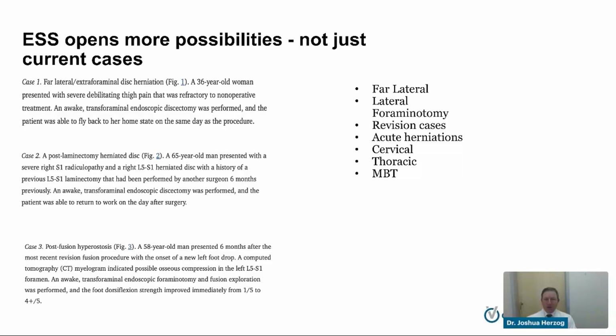I like to talk about what endoscopic spine can do. Not only can it do the same procedure with a smaller incision, but it can do different procedures. One of those examples is this medial branch transection. Whereas we used to still go in and burn the nerves, we can now go in and find that nerve and see the nerve because, again, we're blowing it up. It's a very small nerve, 1 to 2 millimeters, and we can see it and then sever that nerve or ligate that nerve. And that's just not possible necessarily with the naked eye, so we use the endoscope to do that.